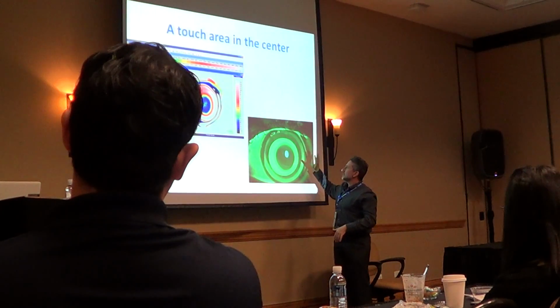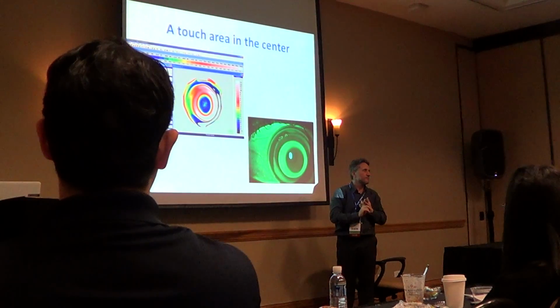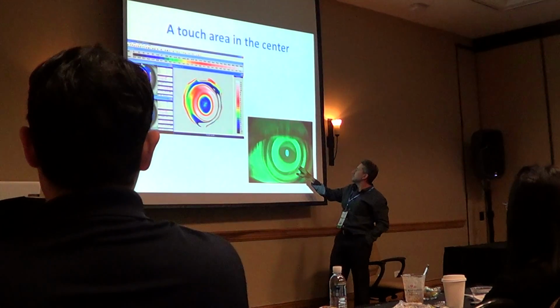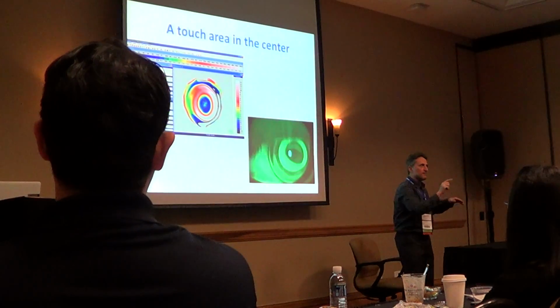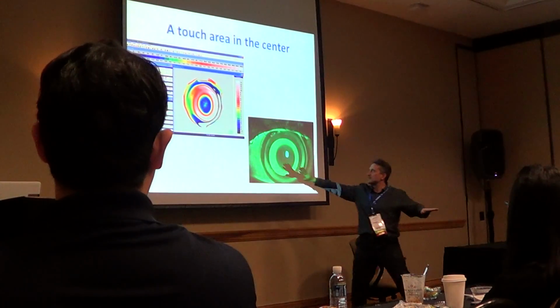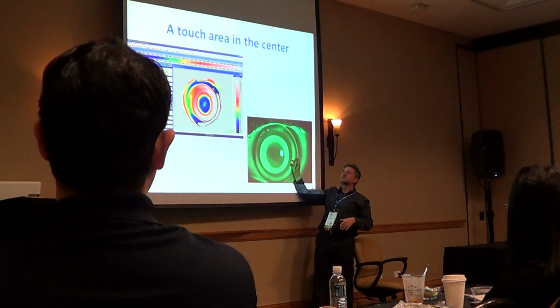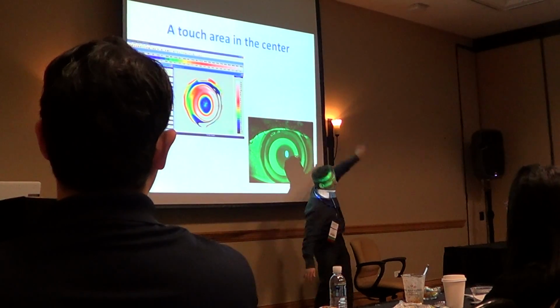So first assessment we have. Okay, let's go. First thing, central zone, touch. Alignment on nasal temporal is too steep here and too flat at the opposite. So why? Because the lens is moving. If we put the lens in the center, we will have equal peripheral edge lift. So the landing zone in this area and this area is too flat. Here the lens is touching and the opposite side the lens is rising like this.